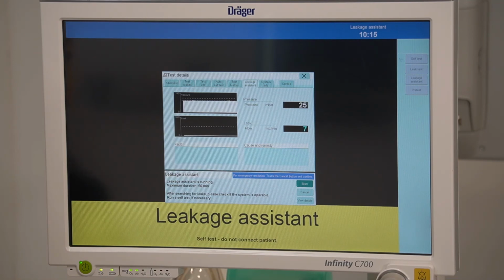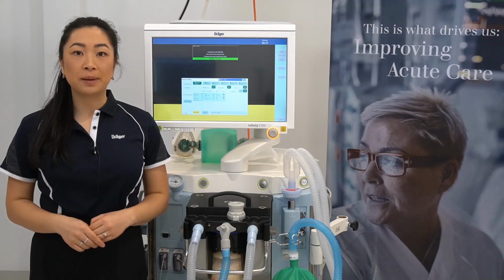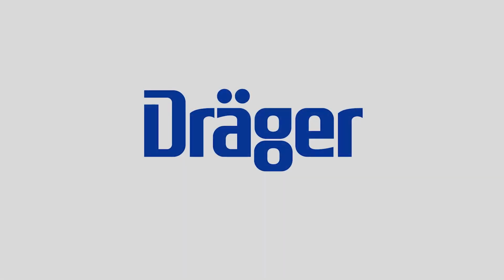Green indicates that the device is completed and operable. Yellow will indicate that the device is conditionally functioning and partly operable. And red indicates that the device is not operable. Please contact your technical service team. If a self-test is cancelled, this will be stated here instead of completed.